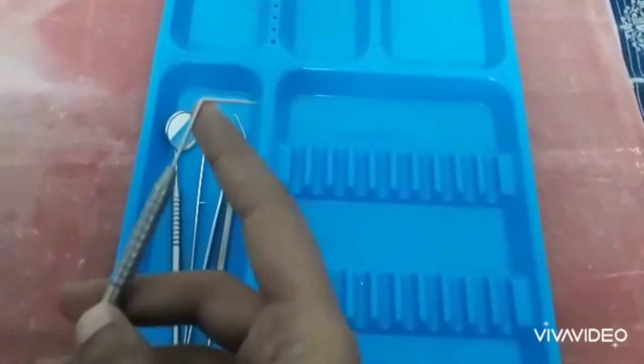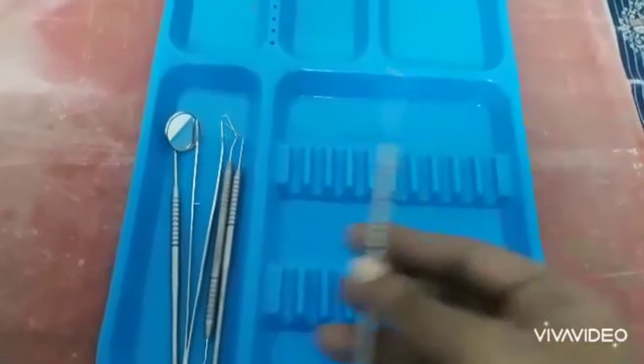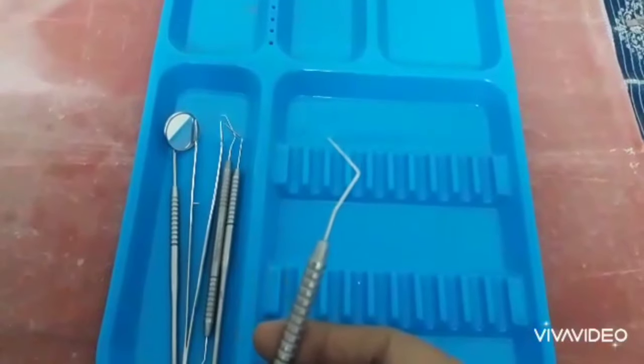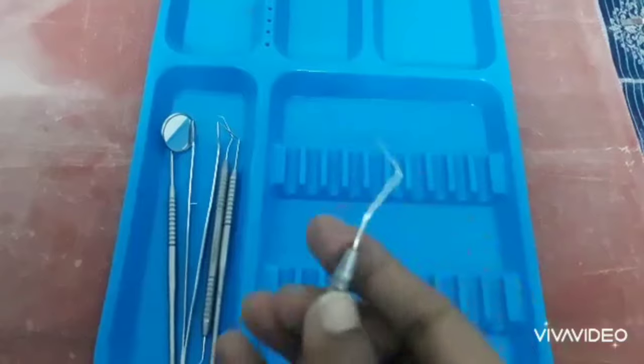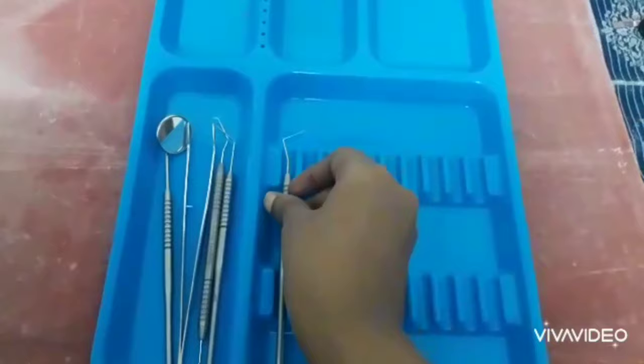First of all, diagnostic instruments. We will have a mouth mirror, a periodontal probe, a tweezer, and an explorer. In this order, we will have diagnostic instruments. This is the diagnostic set with a normal probe.